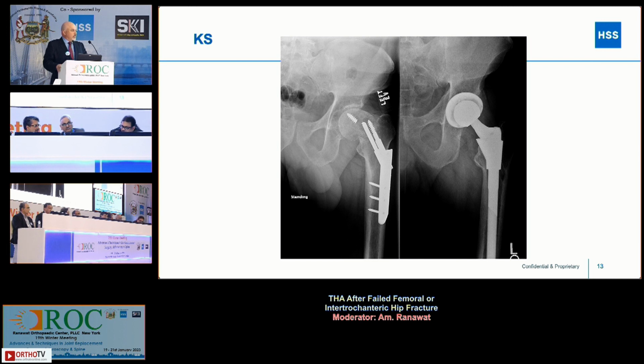So we always take a consent from the patient that there is a possibility I will not be able to remove your implant and I have to just abandon the procedure. Yeah, I think there may be... Each and every operation theater in our setup is not fully equipped.